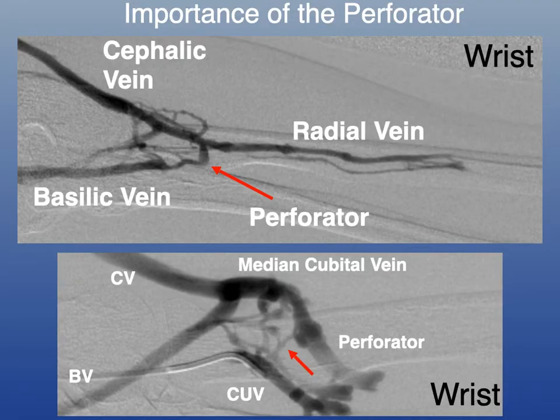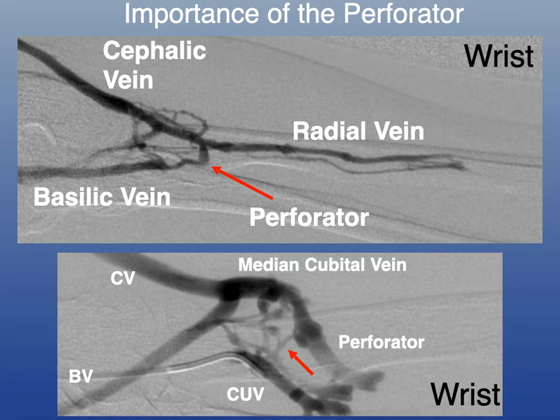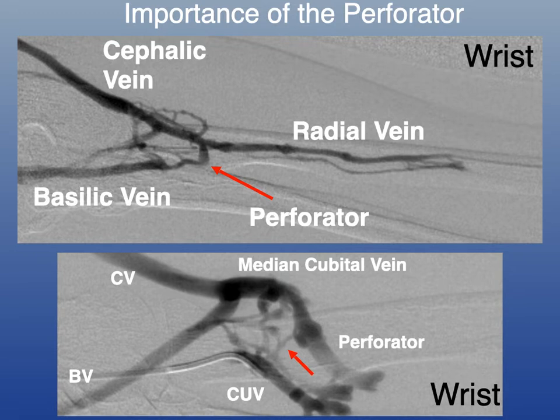Looking at these venographic images, the red arrow is showing a perforator — a connection from the deep vein to the superficial veins. Normally blood flows from superficial into deep veins, but with a fistula, arterialization of the deep vein causes blood to reflux via the perforating vein, often into a median cubital vein and ultimately into a cephalic or basilic vein, or in the case of dual outflow, both veins. The bottom image shows a more complex network of bridging and perforator veins.